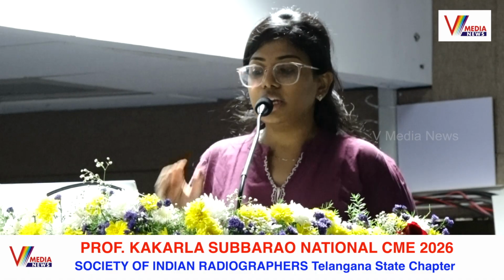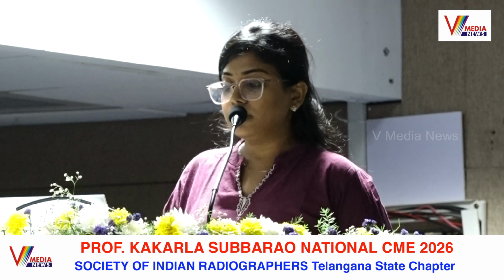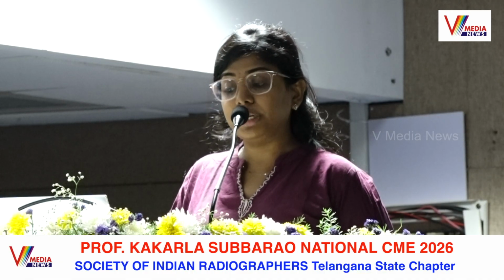Coming to patient screening, before the CT coronary angiogram scan, we should screen the patient to rule out any contraindication like pregnancy or any other pertinent medical history, or inability to follow breath-hold commands. If pediatric patients are unable to cooperate, anesthesia will be required, along with assessment of heart rate, pulse and BP. We also check for contraindications to iodinated contrast agents, because of renal insufficiency, metformin-containing medications, or prior allergic reactions, or contraindications to nitroglycerin, and contraindications to beta blockers because of asthma, AV block, COPD, decompensated heart disease. These are all contraindications.